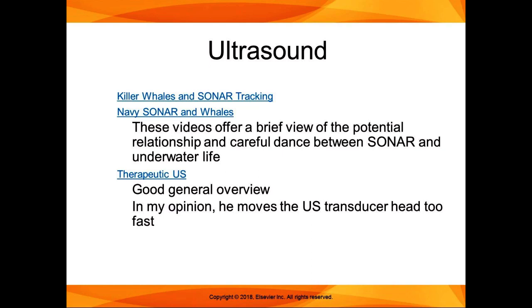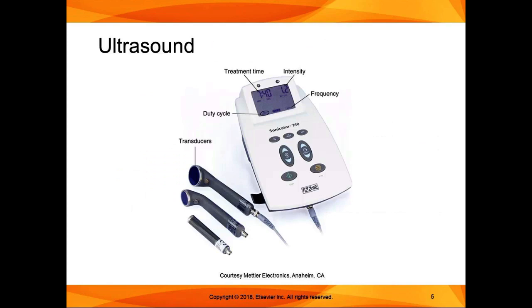There are also the modality application videos from the publisher of the textbook that you have access to, and they have ultrasound videos in there as well. And those ones are nice and short. So this is your standard ultrasound machine that you'll see in the clinic. The major manufacturers are like Chattanooga and Mettler, electronics manufacturers. There are usually different size transducer heads for different size body parts, and we'll talk about all the different settings and treatment. For those of you that have worked as aides in clinic, you are probably very familiar with these.